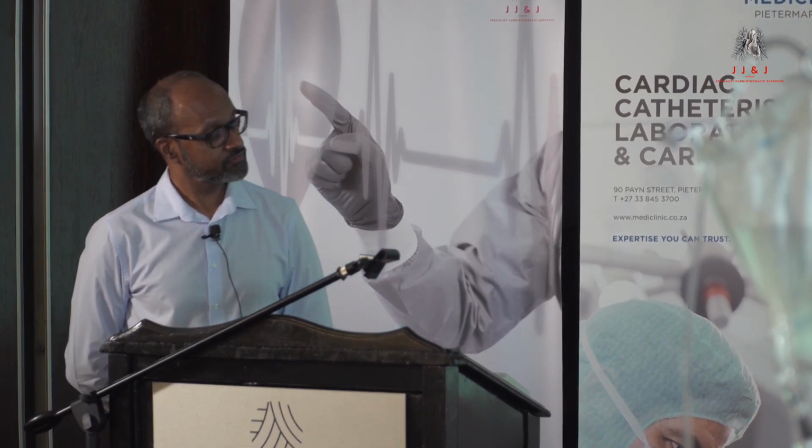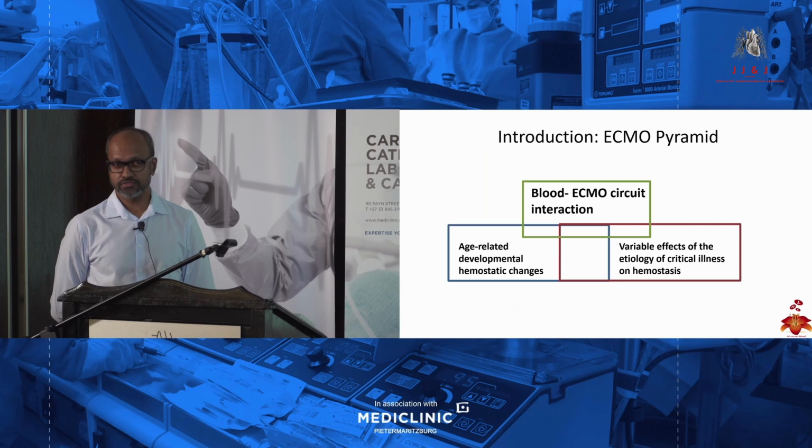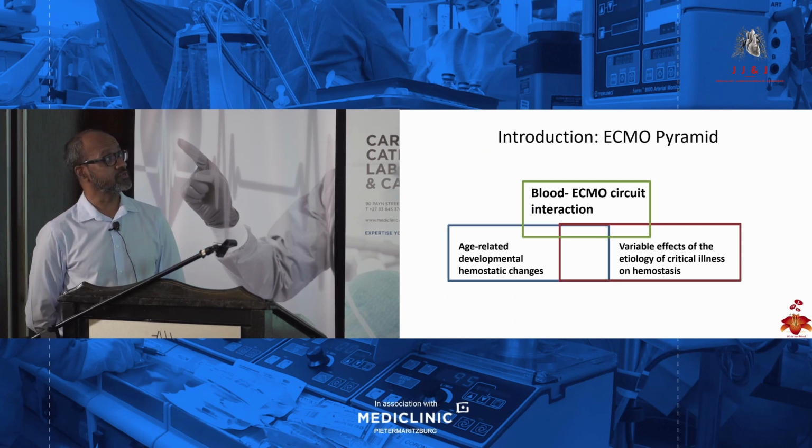And one of the things that we all know about in this room is the ECMO circuit. Are we using a VV or VA circuit that's anticoagulated, etc.? All of that is important to know when we make a decision to put a patient on ECMO and what the outcome is going to be.